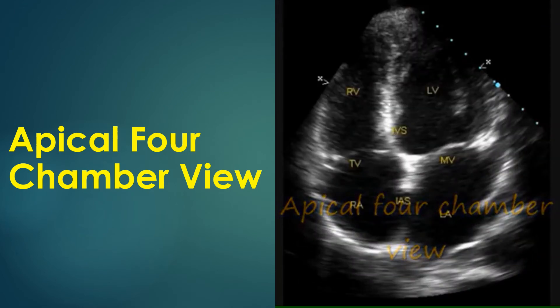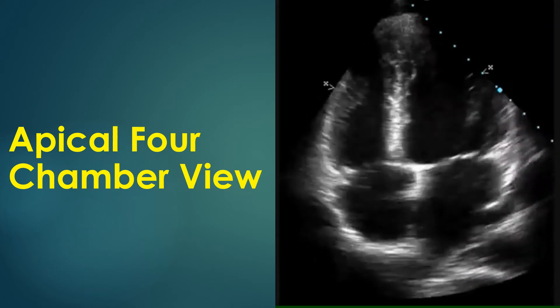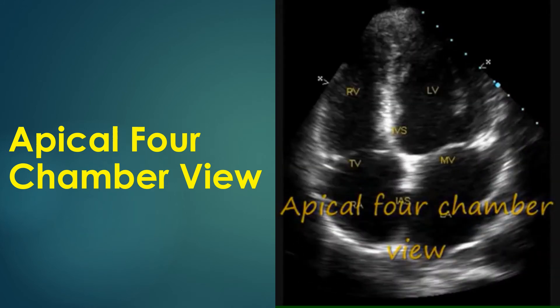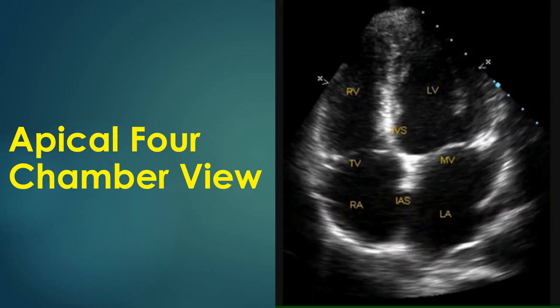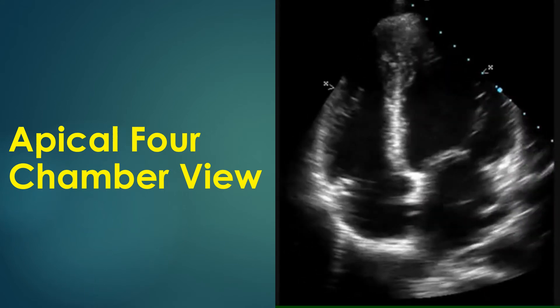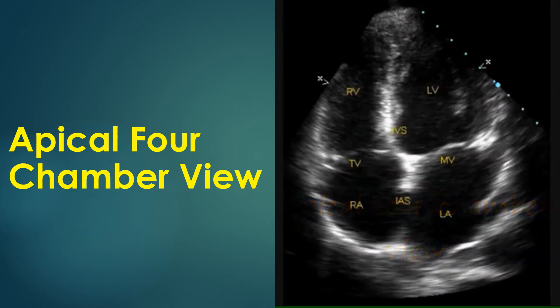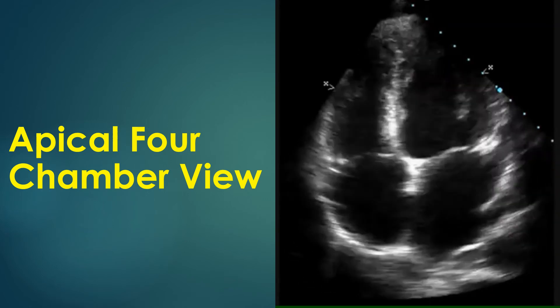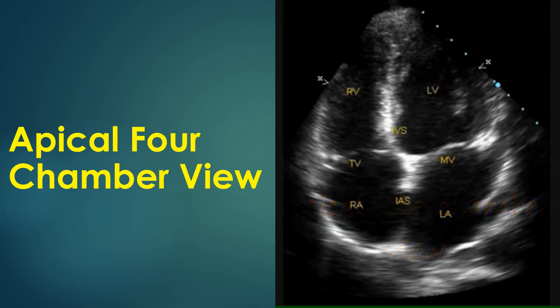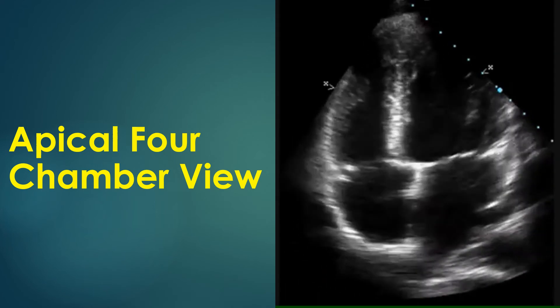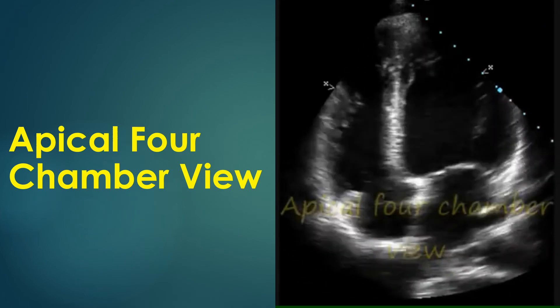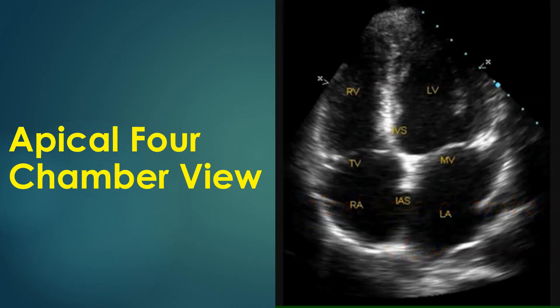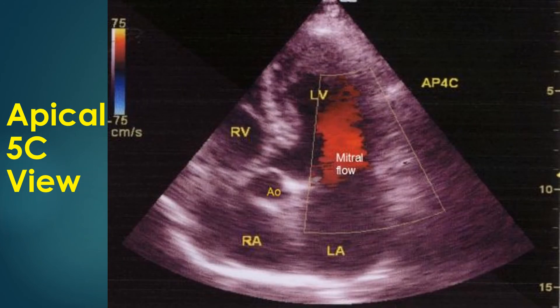Dropouts in the inter-atrial septum are common in this view without any atrial septal defect. This is because the ultrasound beam is parallel to the inter-atrial septum, and the thin region at the fossa ovalis is often seen as an echo dropout. A subcostal view should be obtained to image the inter-atrial septum before concluding that the dropout is an atrial septal defect. A good left-to-right flow demonstrated by color Doppler can also be used to confirm the presence of an atrial septal defect, especially if the subcostal view is suboptimal in some adults.